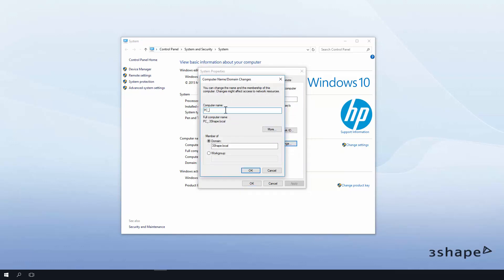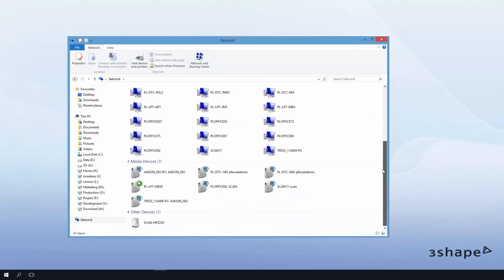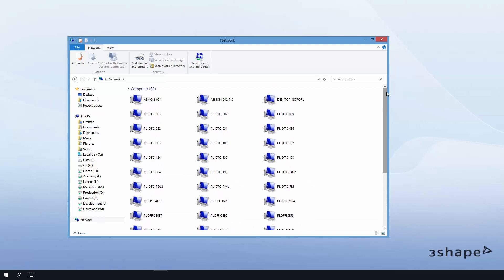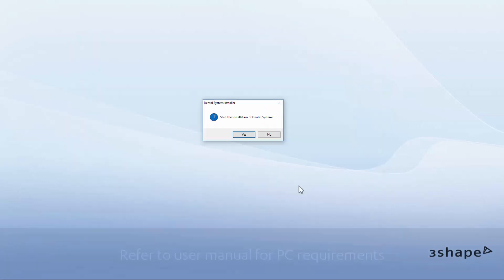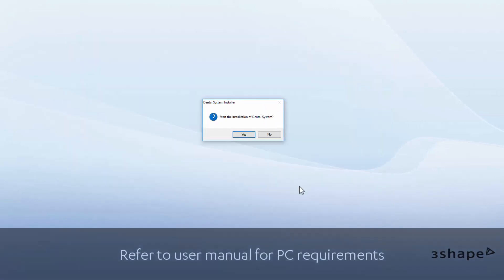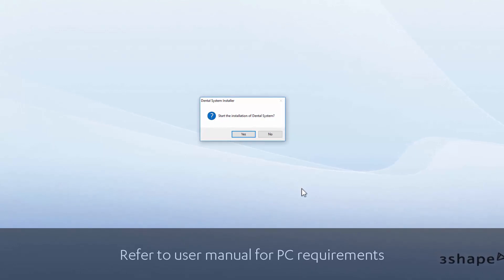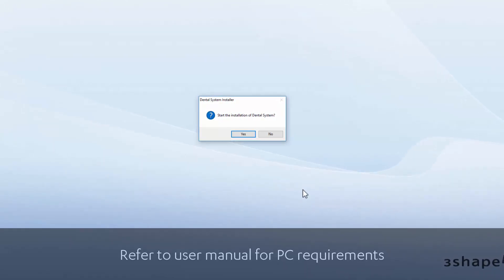After that, place the dongle in the server PC and start with the server installation of the 3Shape Dental System. The hard drive speed and network bandwidth are important for scanning and the server and database operation performance.